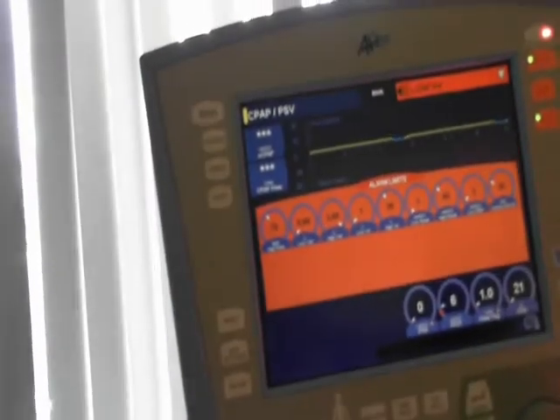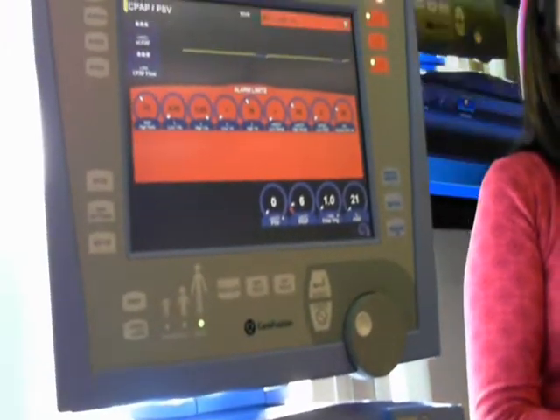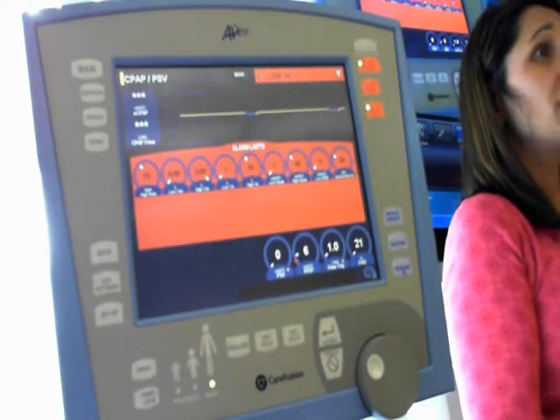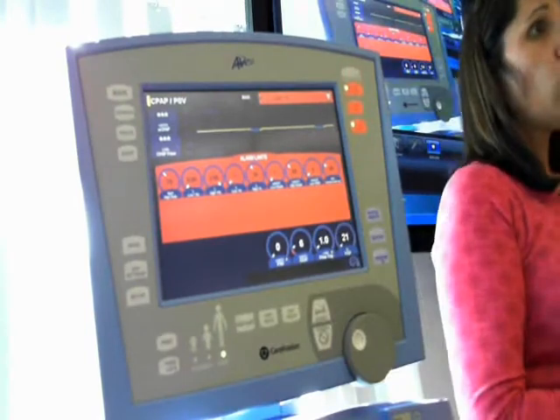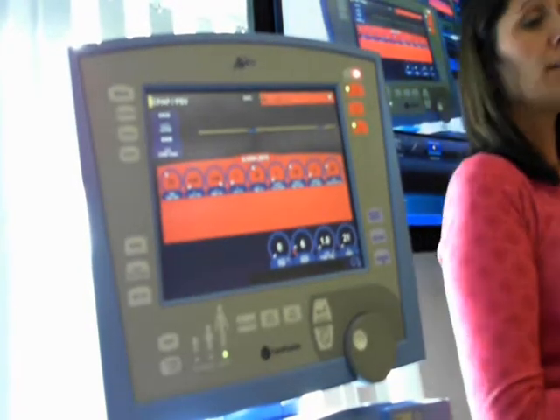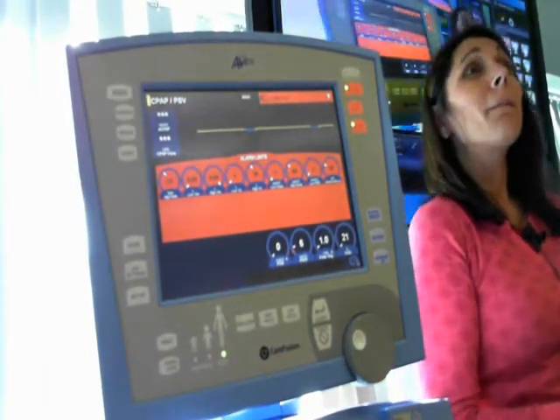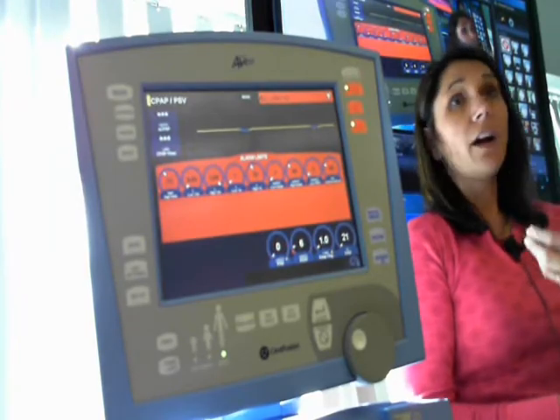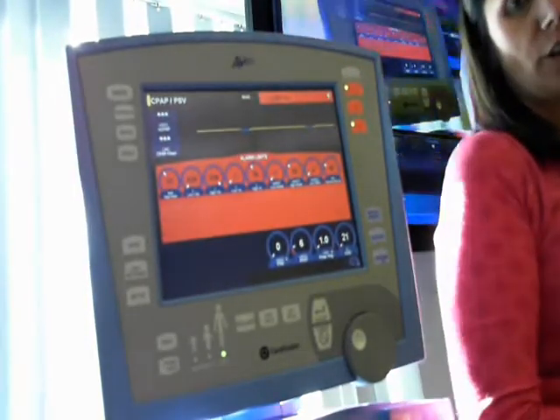One of the most common is going to be that the cuff on your endotracheal tube has gone down. Your intubated patient should not be able to talk to you. You do not want to hear their sweet voice unless you intended the tube to be out. Okay? So if your patient sounds like they are gurgling or burping at you, or if they are able to go, "What are you doing?" Sounds creepy when I do it. It should be creepy when your patient does it if they're intubated. That means that your endotracheal tube has moved up above the cords, or your cuff is all the way down. Okay? So your patients shouldn't talk to you. They should not talk to you.